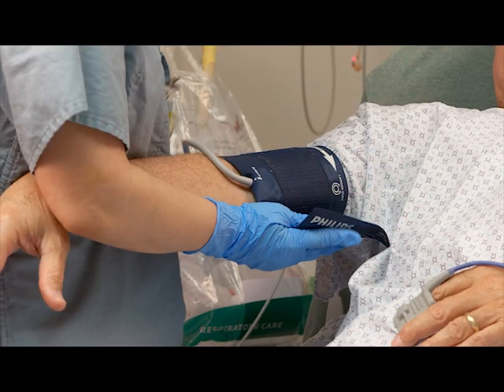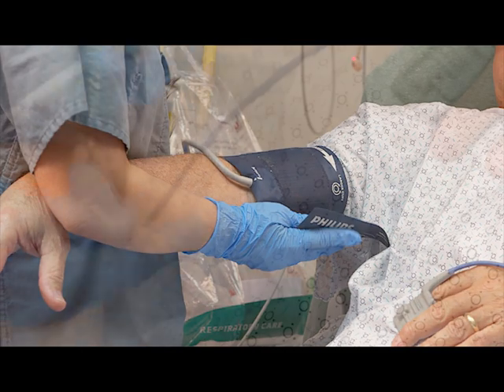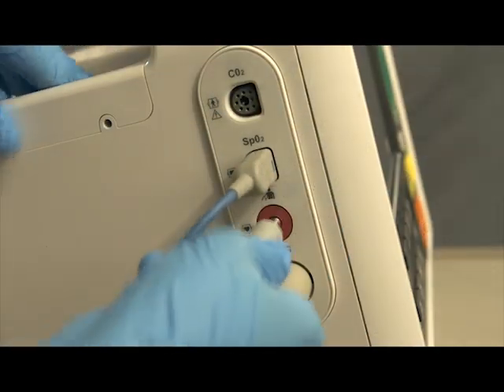The DFM100 can also monitor non-invasive blood pressure. The measurement can be done automatically or manually. The first step is to select the appropriate sized cuff for the patient. The cuff width should be either 40% of the limb circumference or 2/3 of the upper arm length, and the inflatable part of the cuff should be long enough to encircle 50 to 80% of the limb. Attach the cuff to the NBP tubing and the tubing to the NBP port on the side of the DFM100.